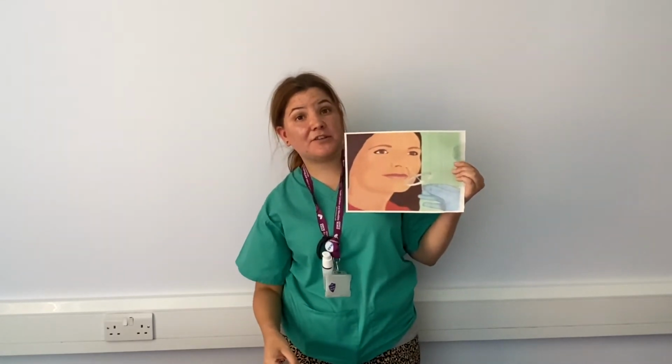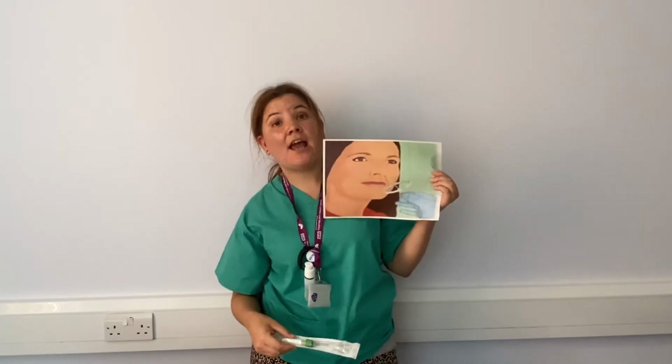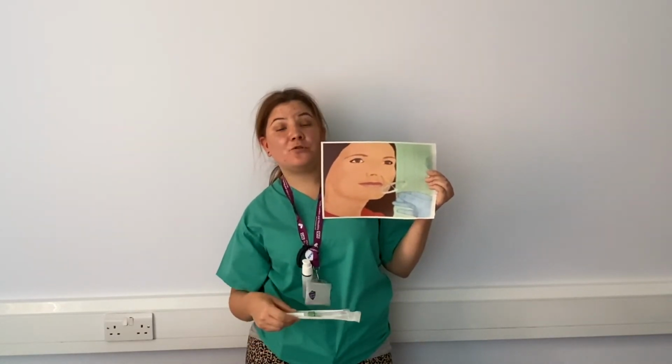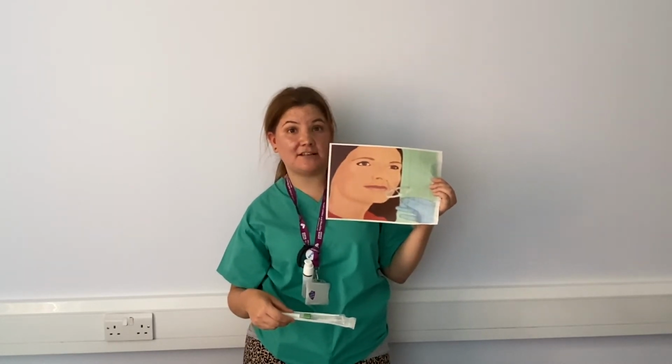You go as far as you can until you feel resistance, and you will rotate the swab gently. In the moment that you feel resistance, you will stop. So you're looking for the surface antigen, the RNA, in the back of the throat and in the back of the nose. And one nostril will suffice, and it's according to Public Health England guidance.